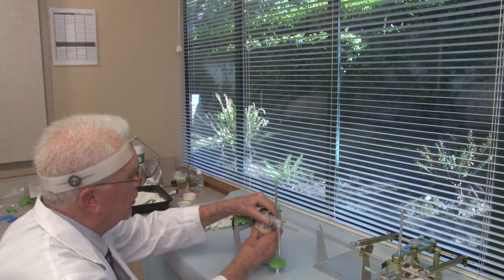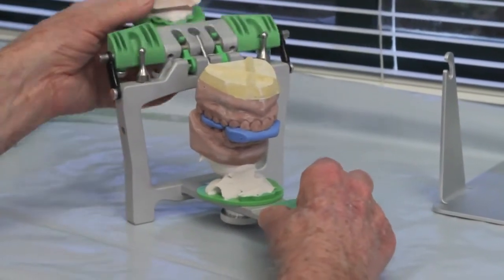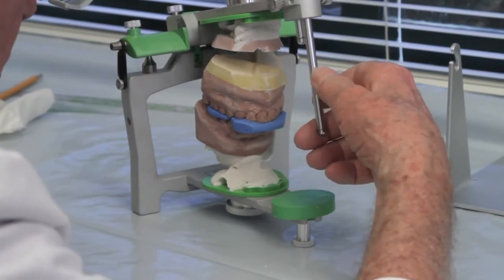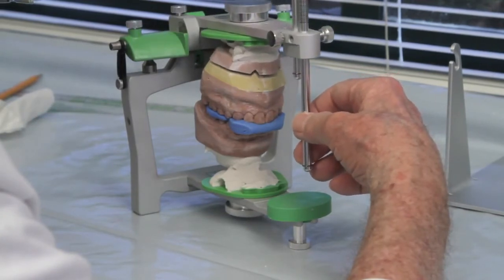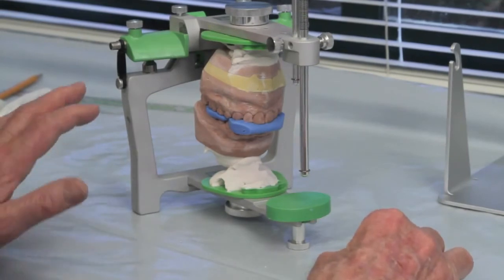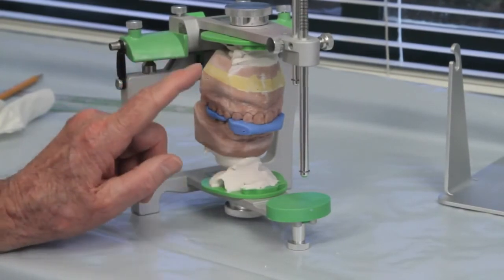Hold the upper model, open the articulator, make sure the upper model is seated in the wax good, and then I'm going to close the articulator very slowly, holding only the pin here so that I can feel good, and I can also watch to see if it comes together without my upper model moving. So it comes together perfectly. There was no movement of the upper model. So I have split cast checked the accuracy of the mounting of my lower model. And so that is the way you use a split cast.